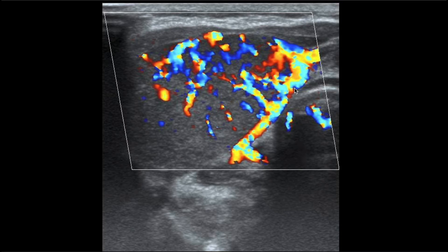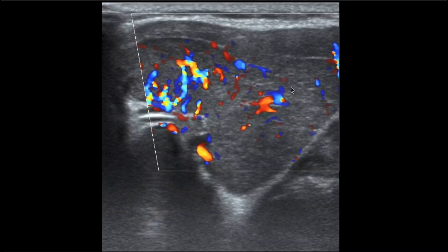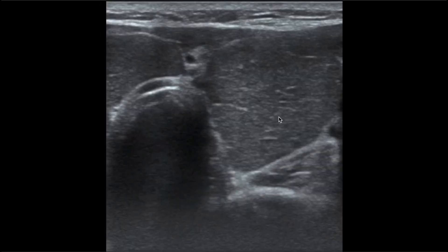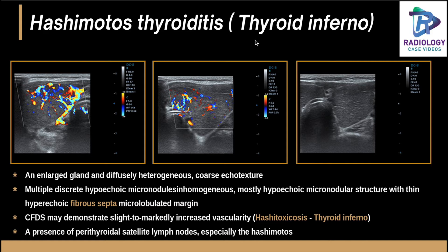Coming to another case: this is a USG image of the thyroid showing intense vascularity. The patient was in a hyperthyroid state, and fibrous septa are visible within the gland. This is a diffusely hypoechoic thyroid with fibrous septa — a classical case of Hashimoto's thyroiditis in the thyroid inferno stage. Normally, Hashimoto's presents with hypothyroidism, but it can have increased vascularity and present as Hashi-toxicosis. Biopsy confirmed Hashimoto's thyroiditis. Finding fibrous septa is important in chronic phases, and numerous hypoechoic nodules and perithyroidal satellite lymph nodes may also be seen.